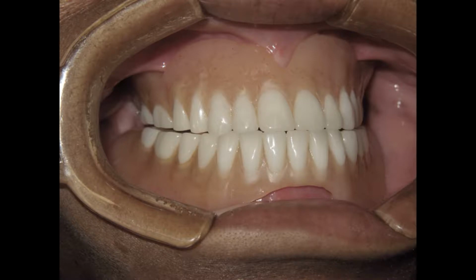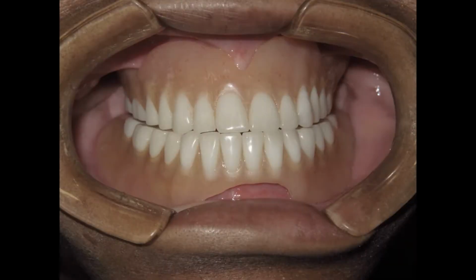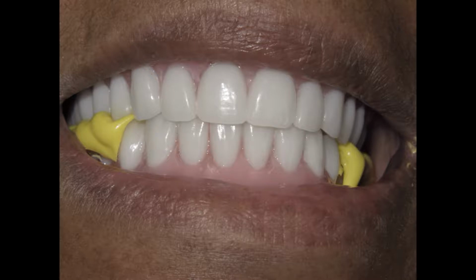As you can see in the images, the patient's existing dentures do not exhibit proper occlusion, and this must be corrected. With improper fit or occlusion, the surgery cannot go forward. During the surgery, an ill-fitting denture means the trajectory of the implants and the bone reduction will be compromised.